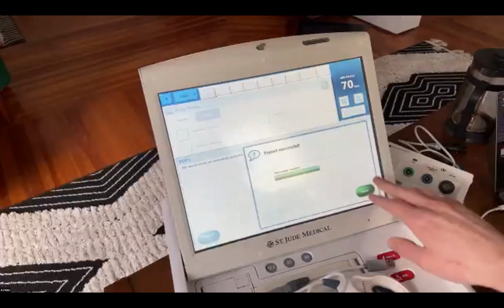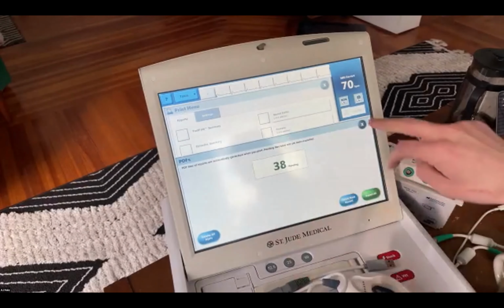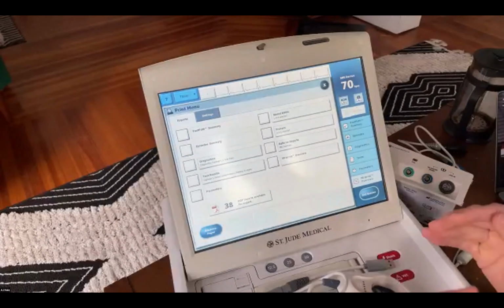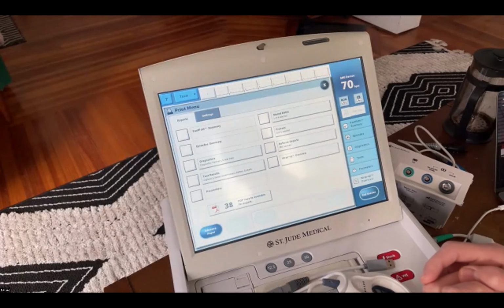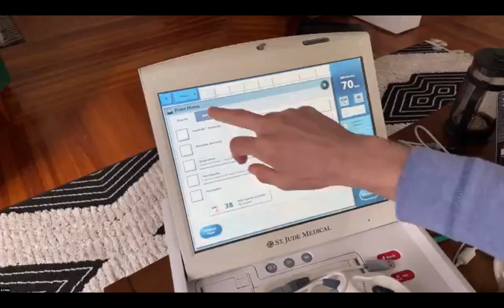You can have it set to go as one file or multiple files in a folder, but the reason I recommend this is just because it might be a good idea to have other electrophysiologists review the programming. If you have questions and you're not as familiar, you can always export it and have somebody review it by emailing it to them. So that's a good way to go about things.